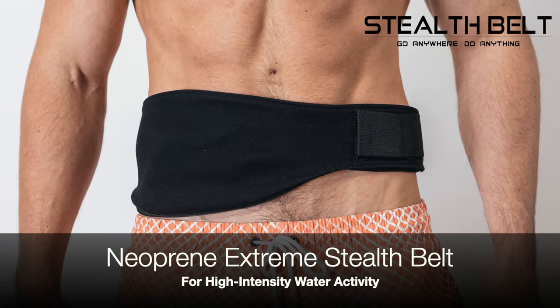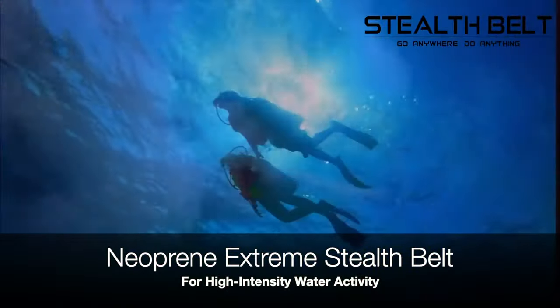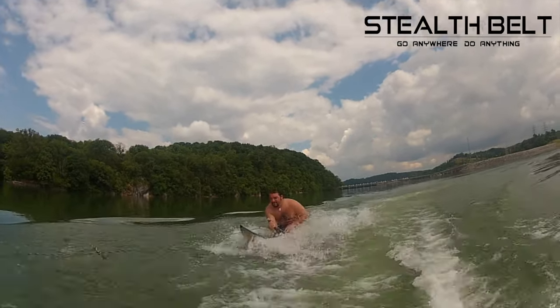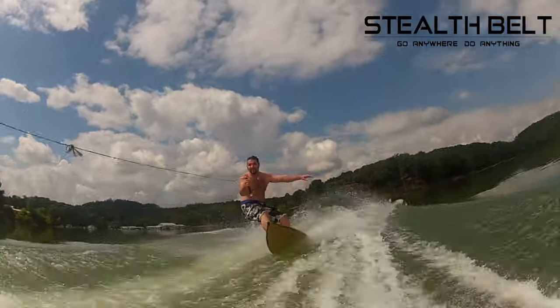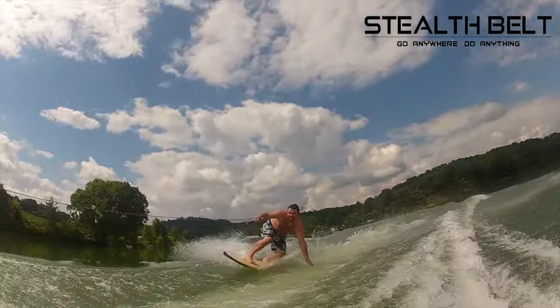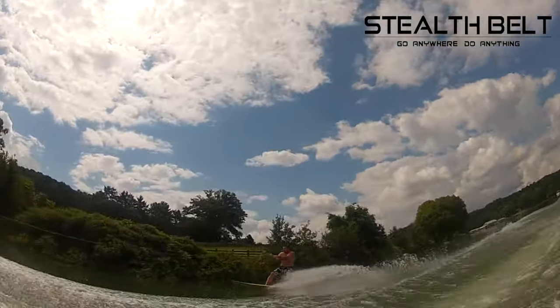Next, we have the Neoprene Xtreme Stealth Belt. This belt is designed for water sports enthusiasts and features a top layer made from neoprene to make it as secure as possible. The Neoprene Xtreme applies much more pressure to the appliance and can be used when moving through the water quickly during activities such as lap swimming, surfing, wakeboarding, diving, and much more.